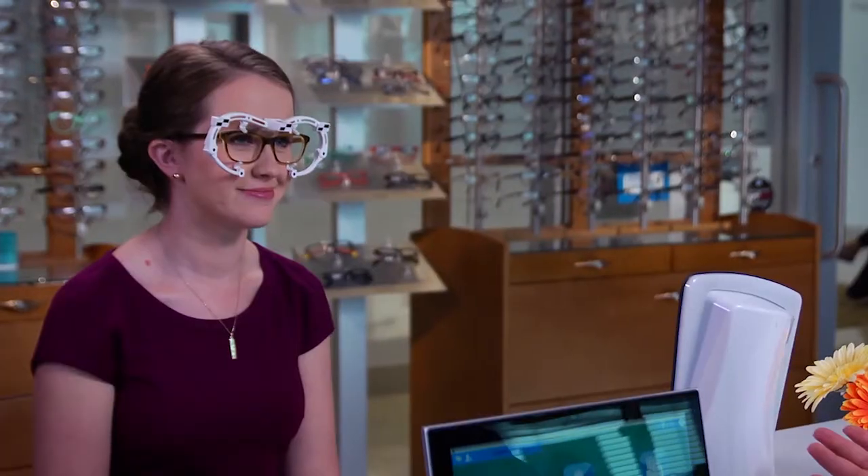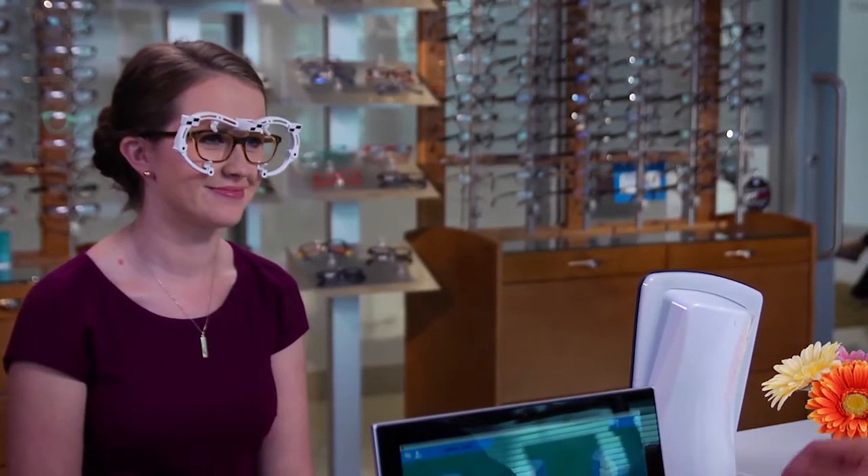This is the MyFit mirror system — it's the very latest in fitting technology. Is this going to take very long? Only a few minutes. And it's very important that you're completely satisfied with your lenses given the investment you're making in the glasses. So let's get started.